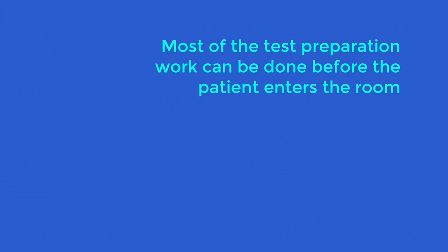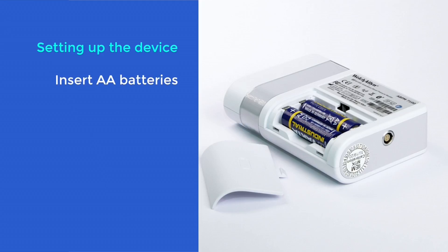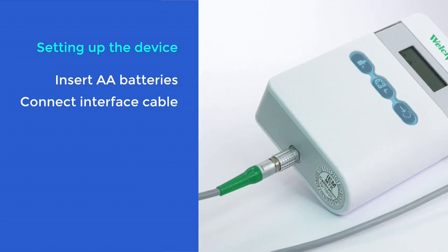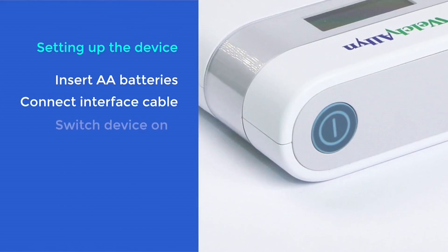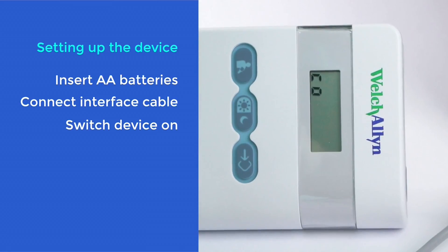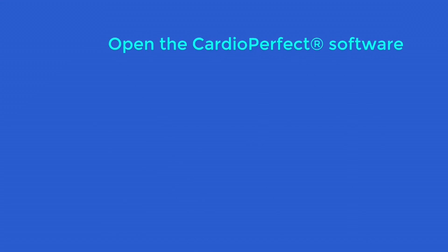Most of the test preparation work can be done before the patient enters the room. First, remove the battery cover from the back of the unit and place two AA batteries into position. Then connect your ABPM unit to the USB interface cable. The cable goes into the port at the bottom of the unit and then into the USB port on your computer. Then switch on the unit using the on-off switch located at the top of the device. The display will now be in co-mode for communication. Open the CardioPerfect software.